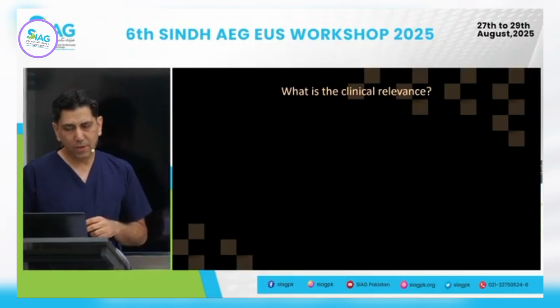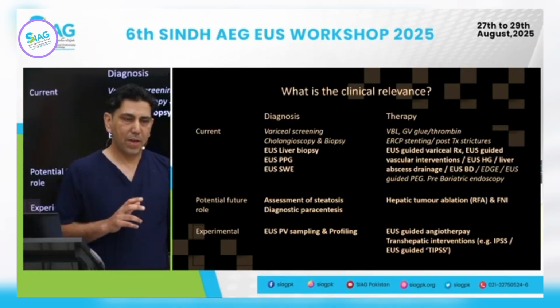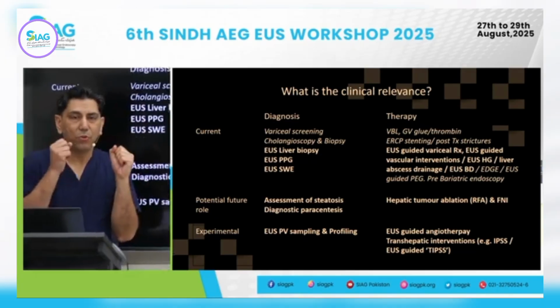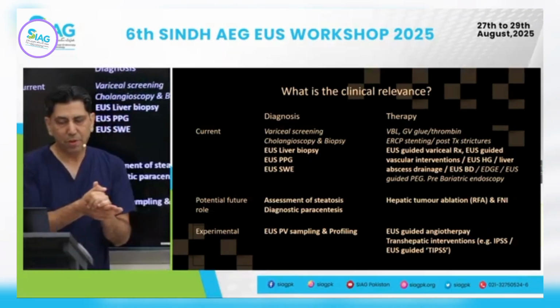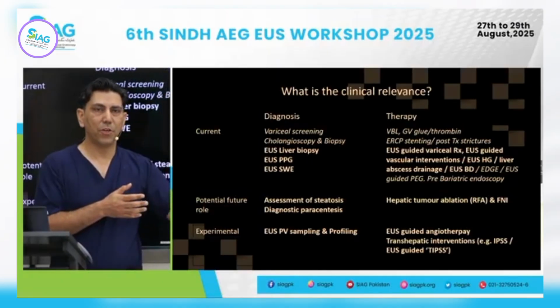Yeah, absolutely. No, you're very right. So, what has actually happened over the last few years, at least in the last 10 years, is that in a number of areas in liver medicine EUS has actually revolutionized the practice. There were things that we were doing previously. We were only dependent on one modality or the other.